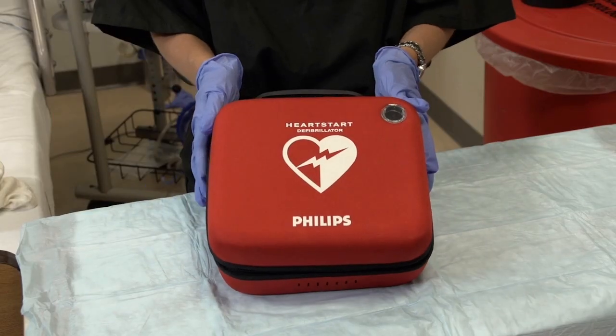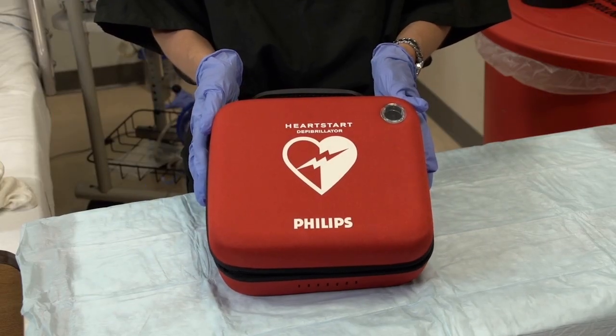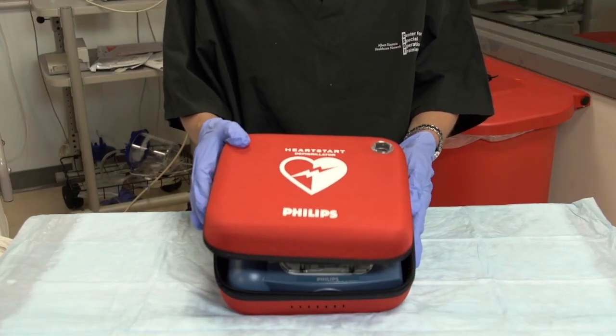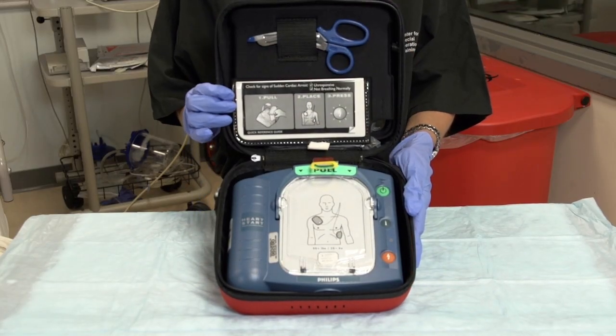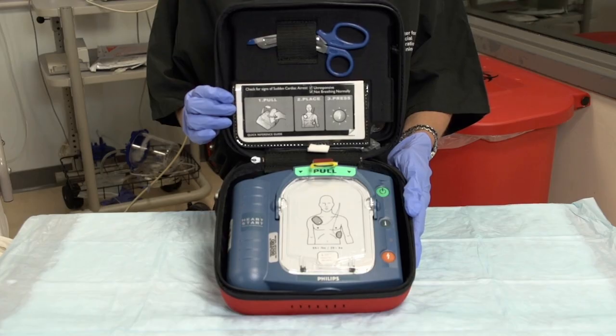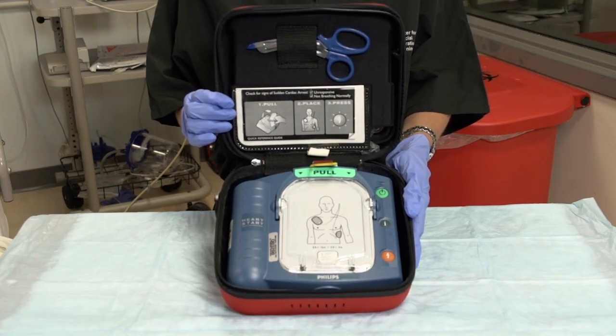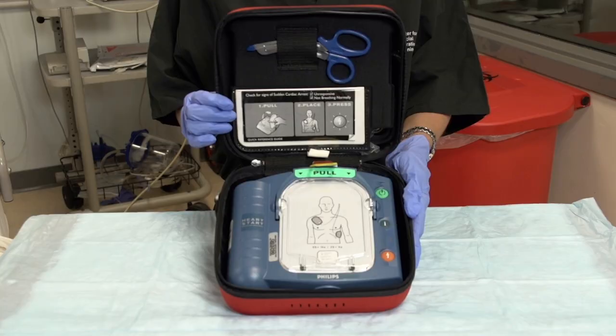There are two types of defibrillator: an automated external defibrillator, usually called an AED, and a manual cardioverter defibrillator machine. Automated external defibrillators recognize shockable rhythms and set current levels automatically. Some AEDs also defibrillate automatically, but others prompt you to defibrillate. AEDs have adhesive electrode pads attached. The pads incorporate a conductive gel.